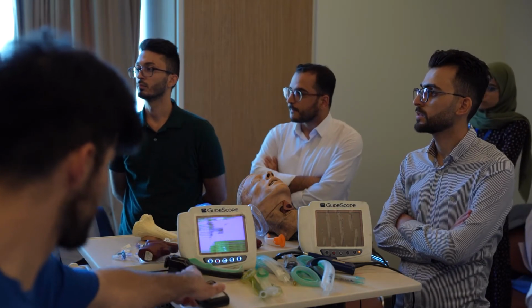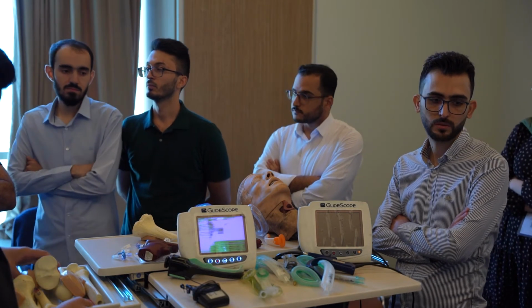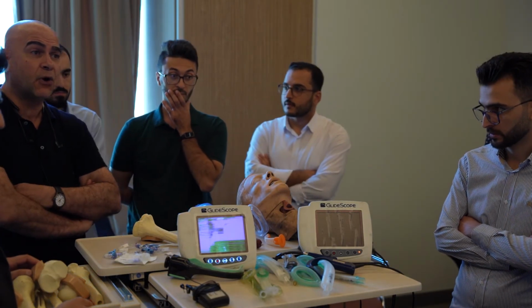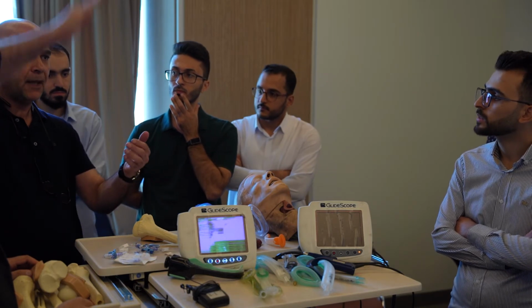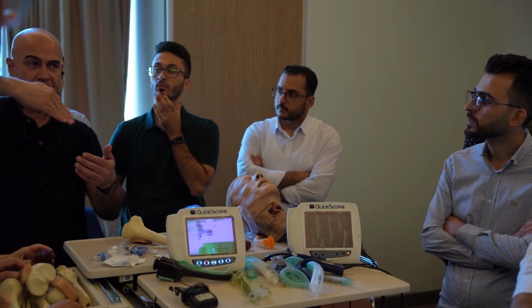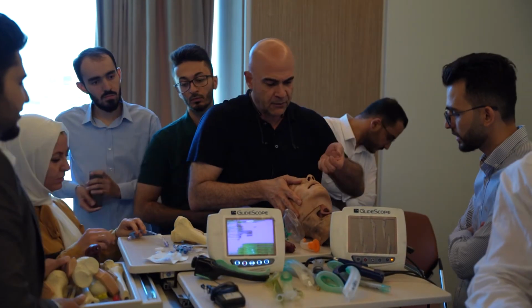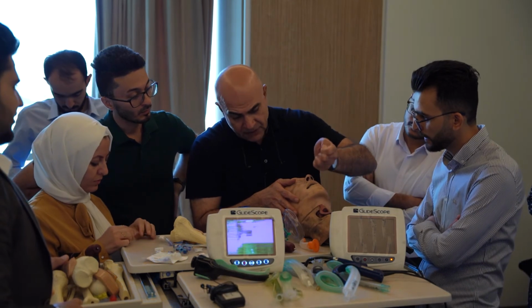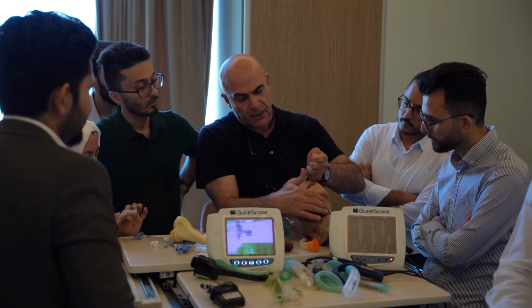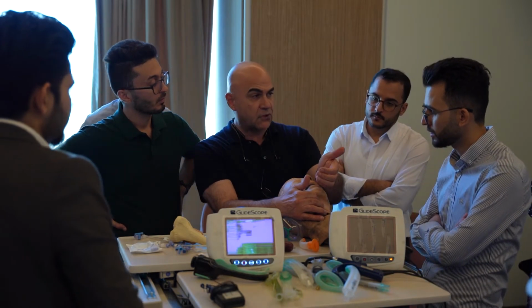If there are 2-3 failed attempts at intravenous access, you are going to use intraosseous access. We are going to talk about it. What if you cannot intubate? You will ask your colleague to do BURP. BURP means backward, upward, rightward pressure, in order to visualize. Sometimes the larynx is placed like that, and it is difficult; I cannot see the vocal cords. So you ask your colleague, or do it yourself, backward upward rightward pressure until you visualize the vocal cords.